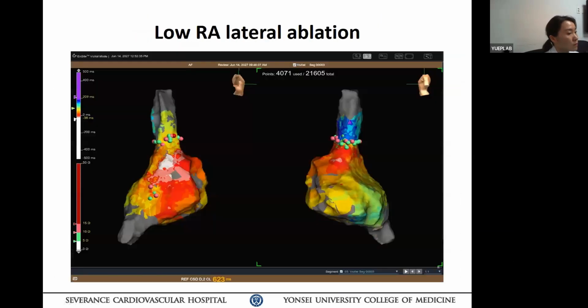I think that Dr. Wang is thinking, oh, if we use PFA, why not? It's simple and easy.